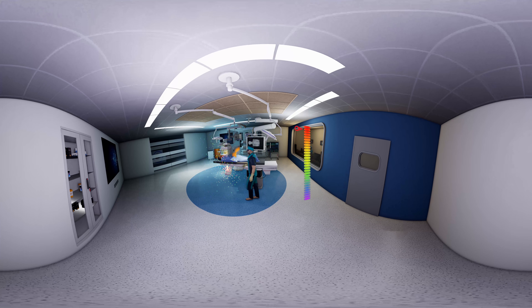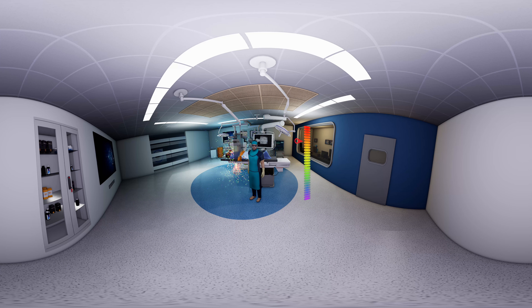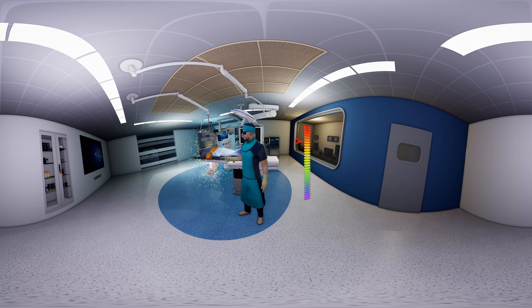Now let's place the OT54 suspended shield above the patient. Straight away you notice the dose reduction. The OT54 is big enough to protect the head and eye lens. The dual cutouts with protective panel curtains have to be placed here along the patient drape.